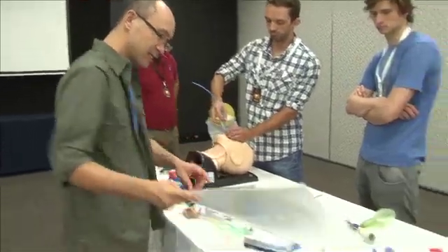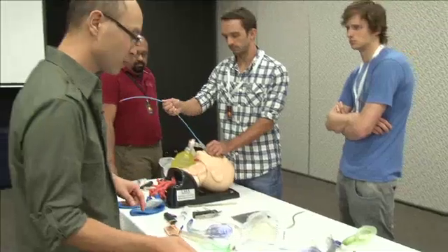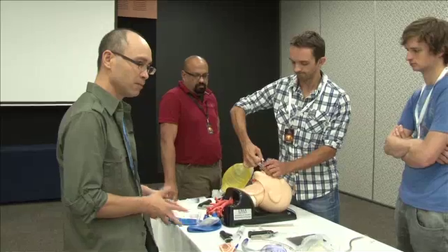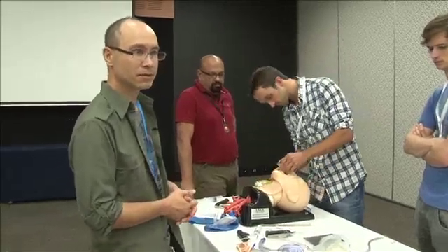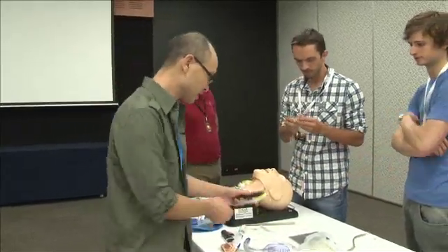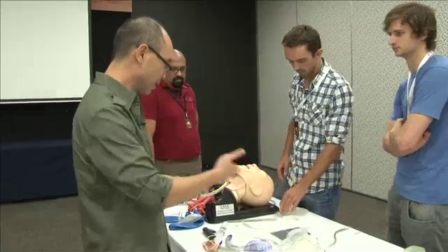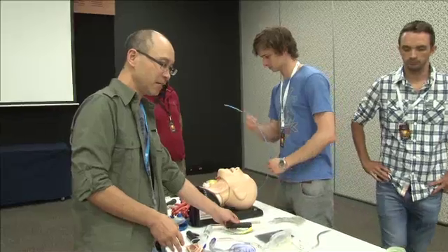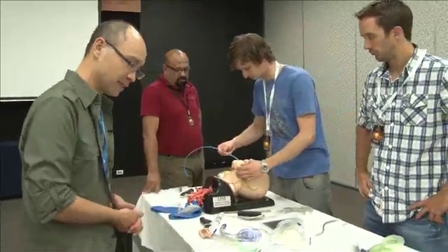Is there another adjunct you can use to help put in a supraglottic or LMA - anything that might be on the table? A laryngoscope basically helps you move the tongue away. If the tongue's stopping you getting your LMA in, then certainly that's a good device. So that can be helpful.